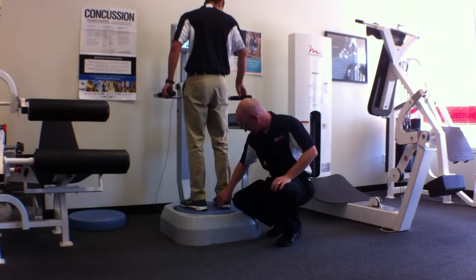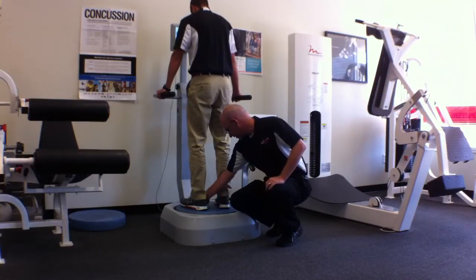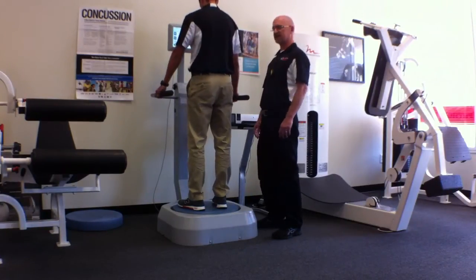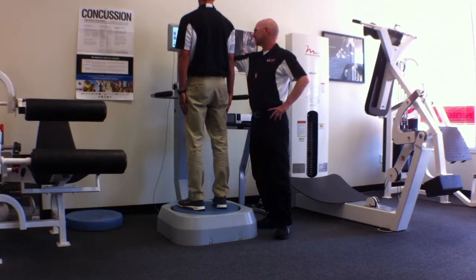So he's about right on that. And his feet, you're going to be parallel to the 10-degree line. So you might bring it just a teeny. This is the line you're going to run parallel to. So a little bit towards the inside, I would say a little bit. There you go. Good. Hands are going to be down by his side, and we're going to move forward with this test. So we're going to accept that foot placement for him.